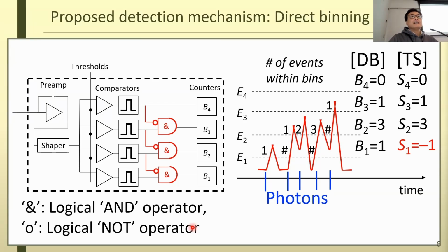Not having a data model mismatch would be critical to get the best results. I'm not sure about later parts of the chain or recon processing. Depending on the succeeding method itself, the value of having a statistical model may not be critical, but it would be wasting information that we could use in the succeeding algorithm.